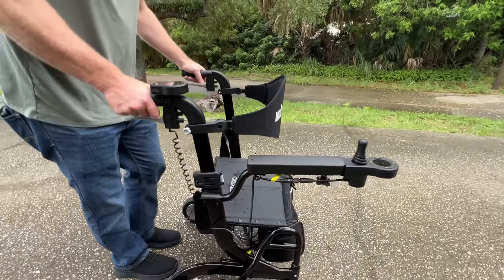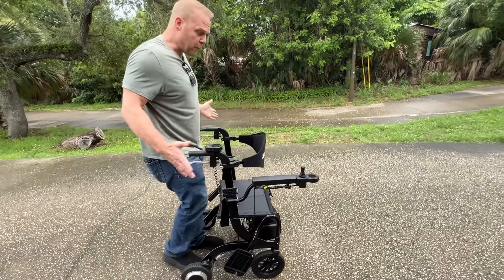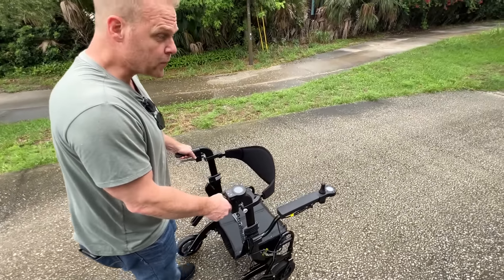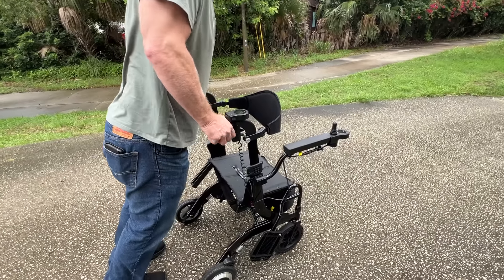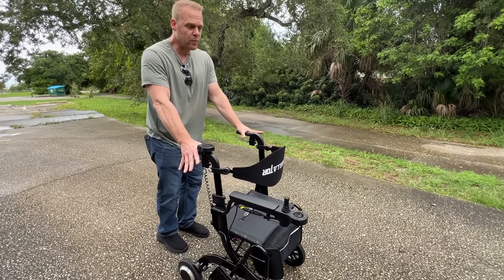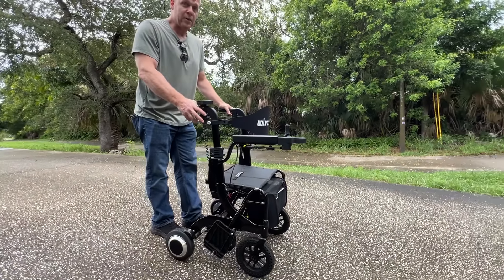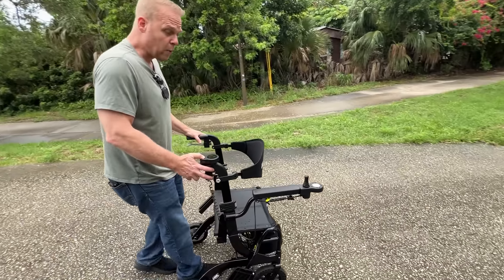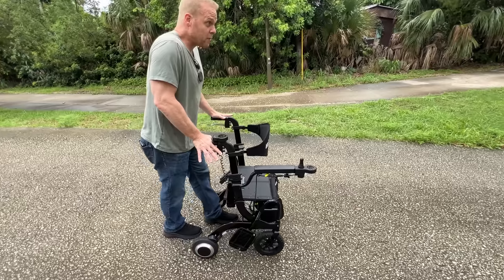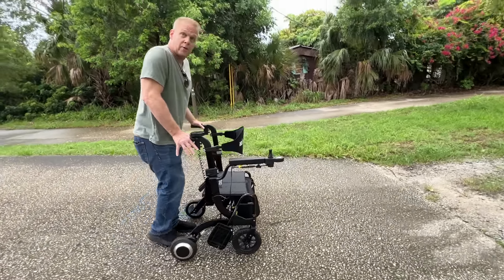It allows me to go down the hill, but not so fast that the device is getting away from me. And if I stop, the device stops. Now if I want to go faster, I'm going to set this to 3 and I can go a bit faster. If I want to go slower, I put it to 0-1 and it gives me a good amount of resistance to get down to the bottom of this hill, so I don't have to worry about slipping and falling.